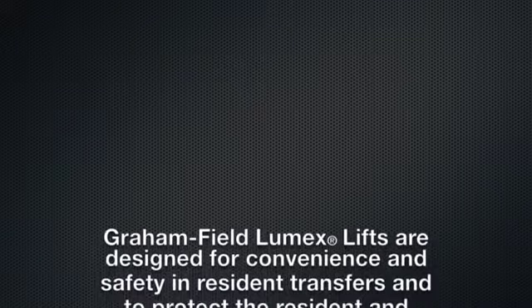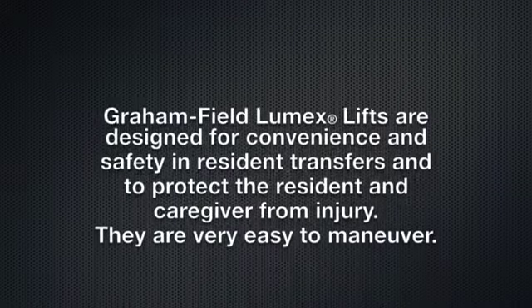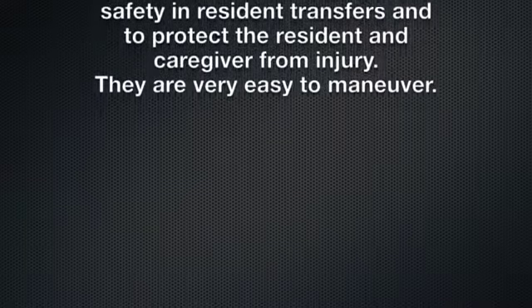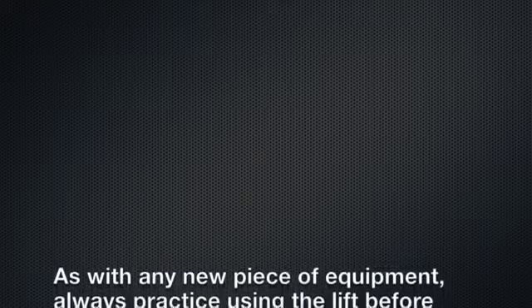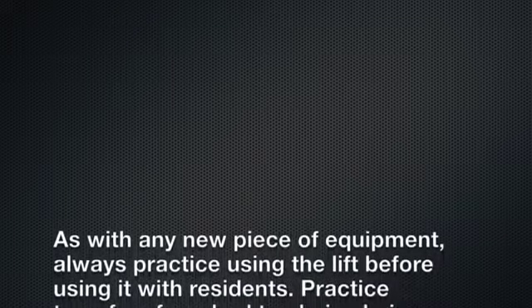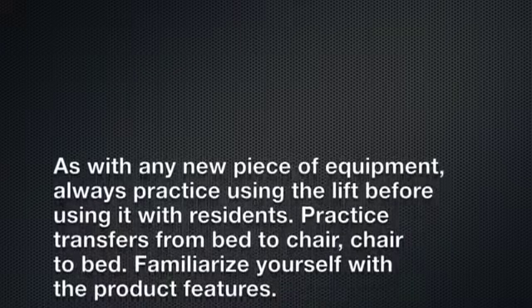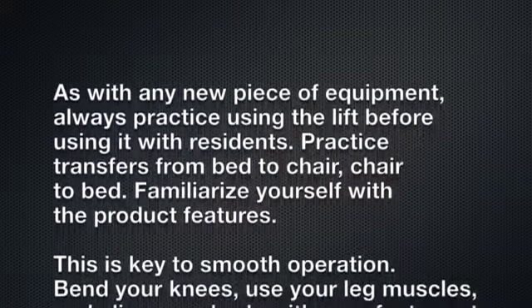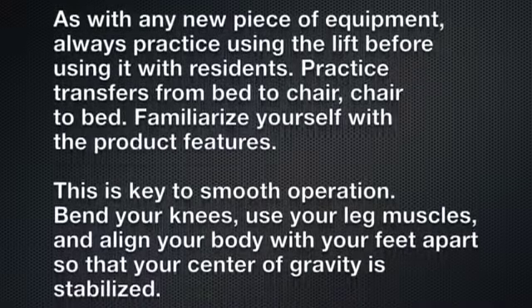Lumex lifts are designed for convenience and safety in resident transfers and to protect the caregiver from injury. They are very easy to maneuver. As with any new piece of equipment, always practice using the lift before using it with residents. Practice transfers from bed to chair and chair to bed. Familiarize yourself with the product features — this is key to smooth operation.